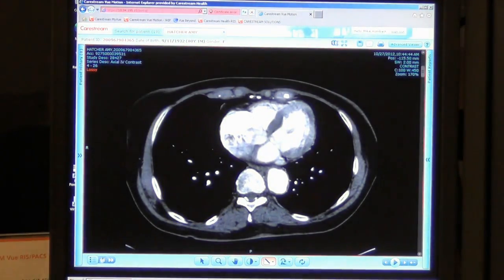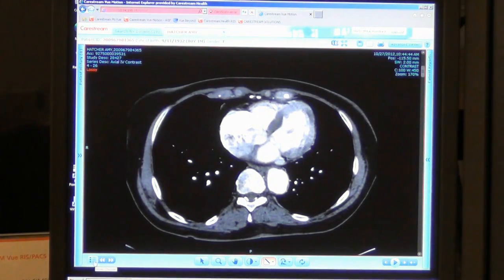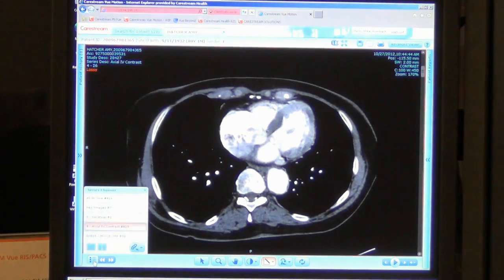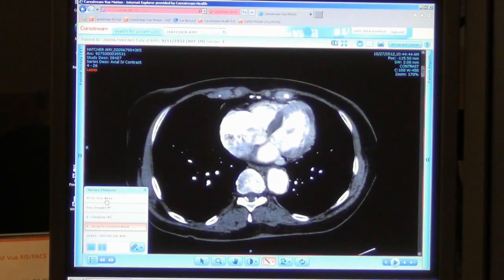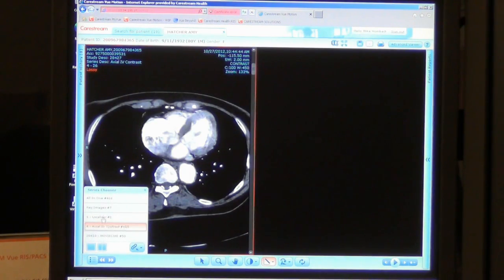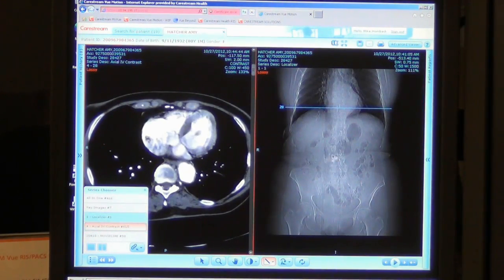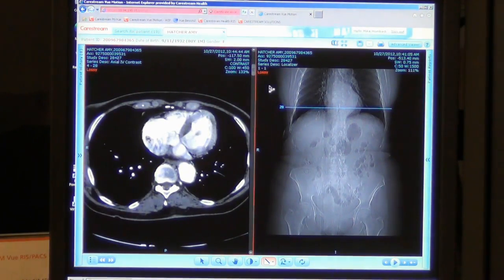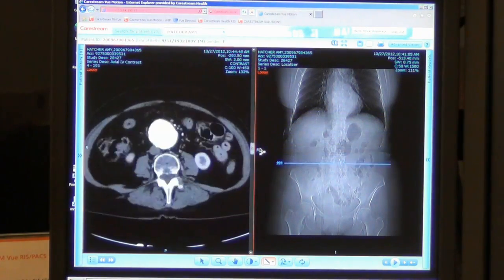At the bottom left portion of the screen, I can actually see any additional series or key images that have been included with the study and split my screen. So if I want to display my localizer with scout marks, I can view it that way.